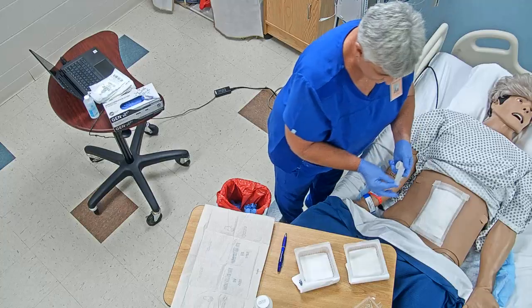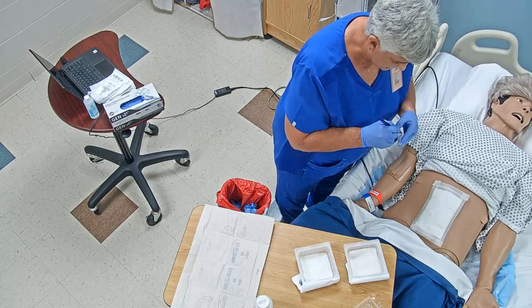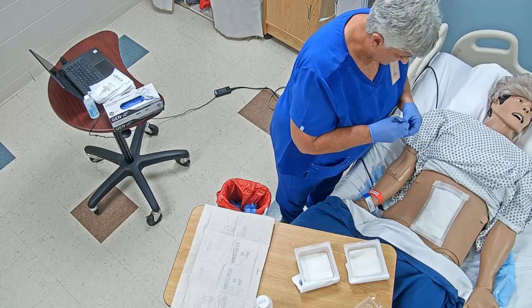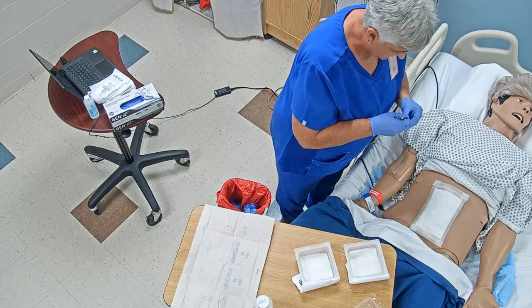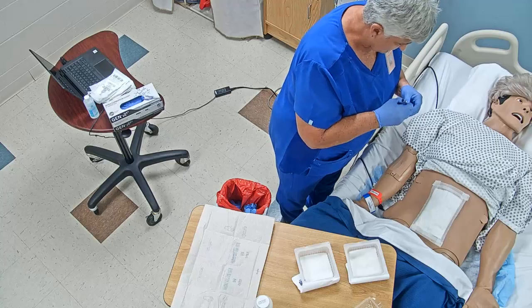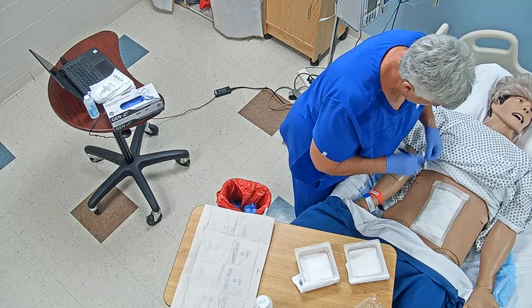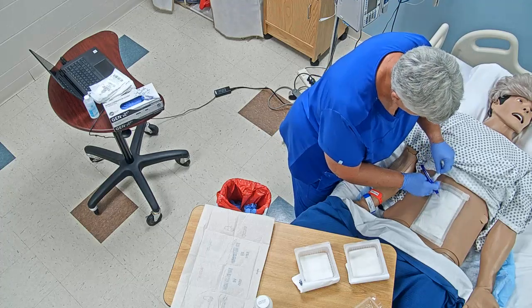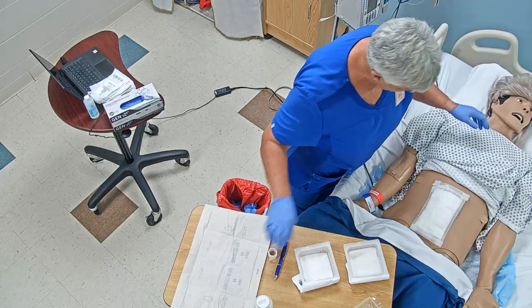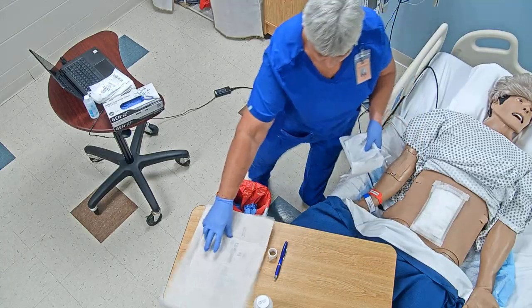Okay, and with this last piece, about a 2-inch piece or whatever you got here, we're going to put our date. The date, the time, and the initials. And we're going to put that right there, so that the next person knows when we did that. And so I'm going to go ahead and remove all of this.